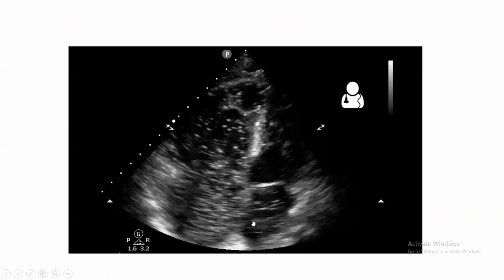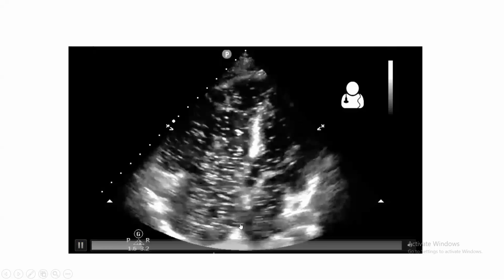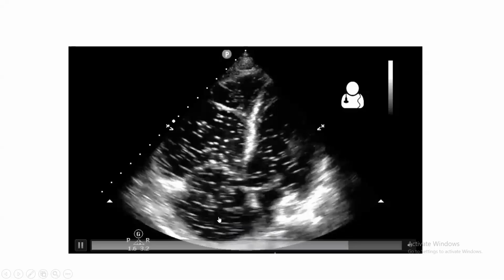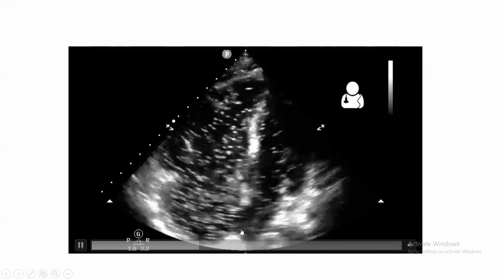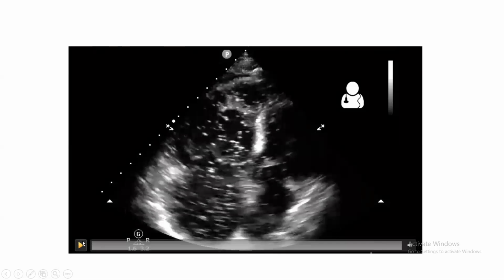Here is actual footage of the same patient with ASD, but in this footage, the heart is upside down. These are ventricles, these are atria. So this side is the right atrium, this side is the left atrium. Checking together again, can you see this cavity here? This is a PFO, in which case the blood from the right atrium goes to the left atrium. You can see this again. That's what is called ASD, or atrial septal defect.